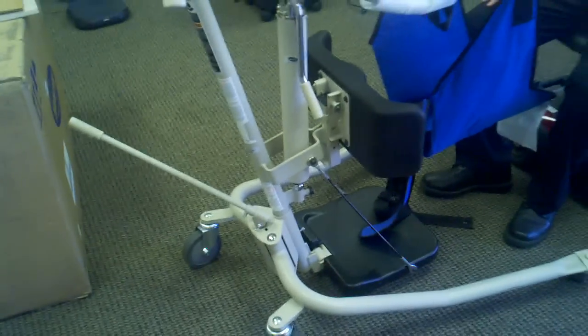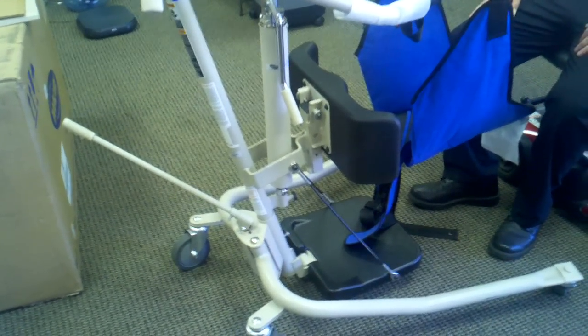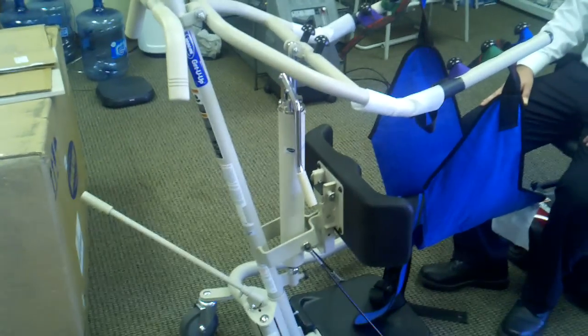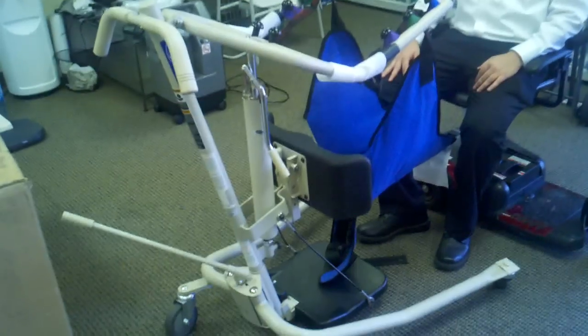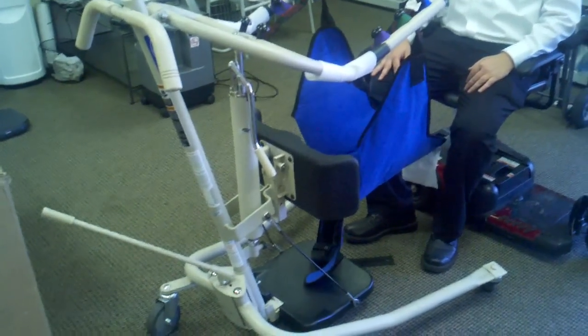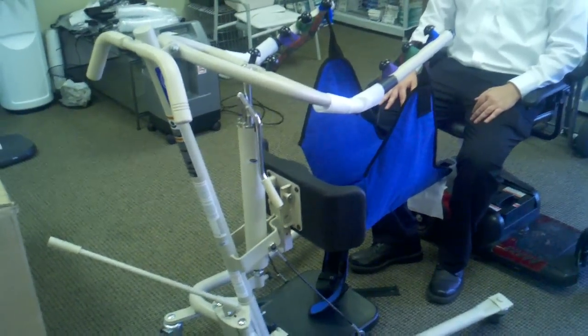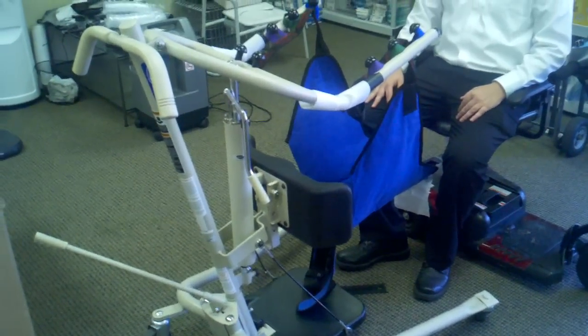Hi, you are looking at the Invacare GS350 Get You Up Hydraulic Stand-Up Lift. This is typical of any lift that you can see on GoSouthernMD.com's website, and this is something similar to what you're going to get when you rent from us under our rental category.